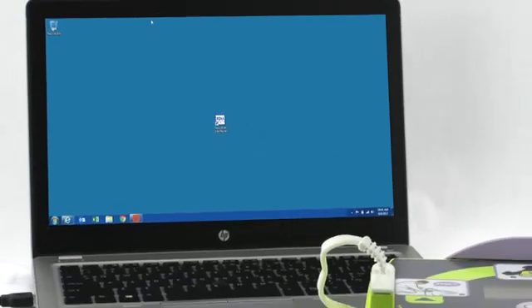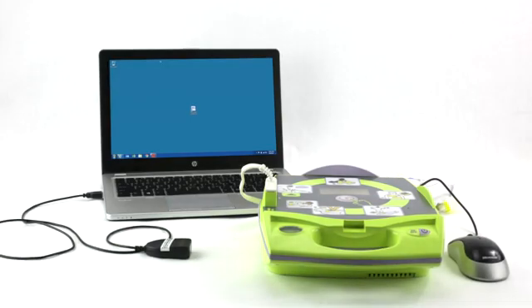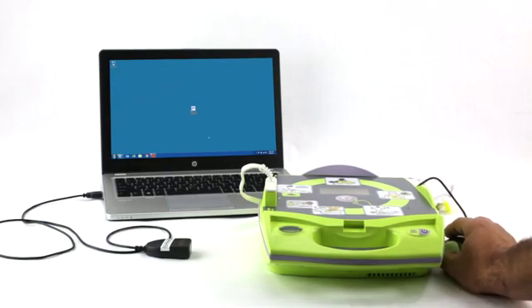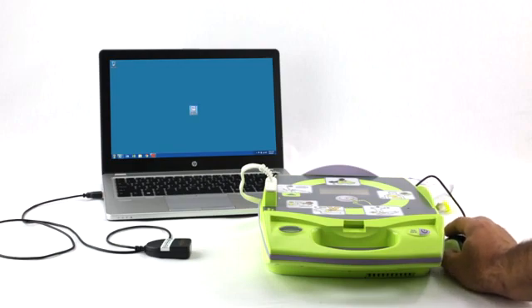Place your laptop with the IRDA adapter inserted into an available USB port next to the AED Plus. Open the Code Review software program. In Code Review, click on the Upload Case from Infrared button on the top left of the toolbar.